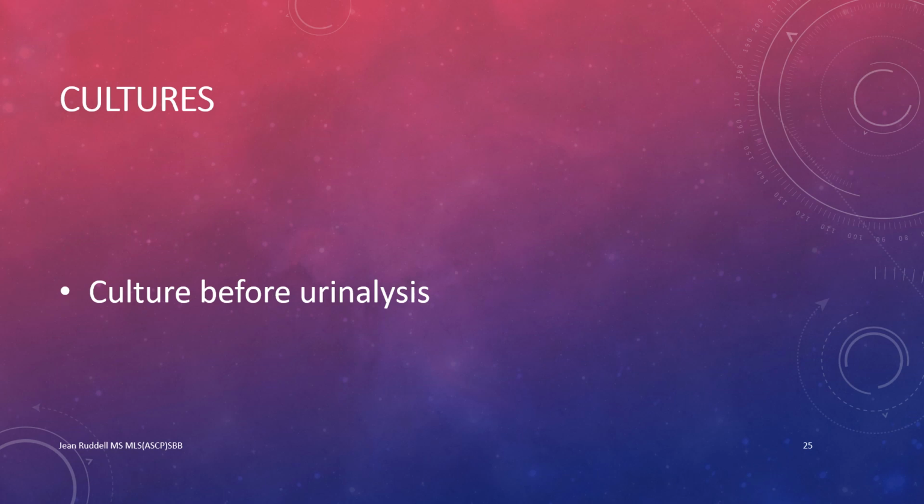Cultures. When both a routine urinalysis and a culture are requested on a catheterized specimen or midstream collection, the culture should be performed first to prevent contamination of the specimen. A collection transfer kit can also be used.